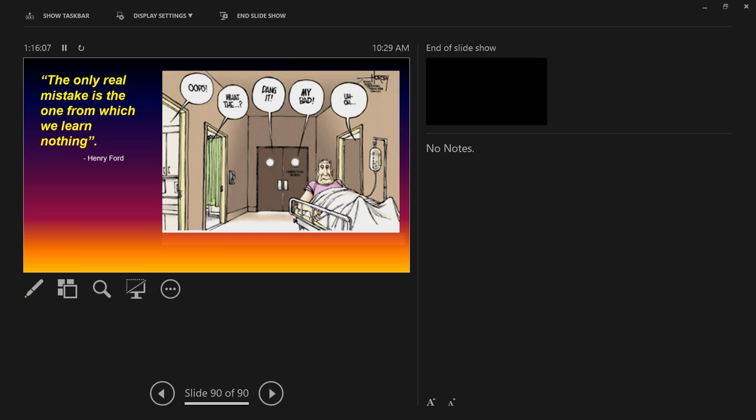Well, more often than not, as that Swiss cheese model implies, the user is kind of the last one, and there's a lot of things that can be prevented if they're aware of it. Again, their defense is the cognitive overload they're functioning under. We remember 10, 15 years ago, ECG leads used to be individual leads. There were a number of fatalities where they took the kid away from the monitor, and came back, and there was a cord laying over the bed with three wires coming off the kid.